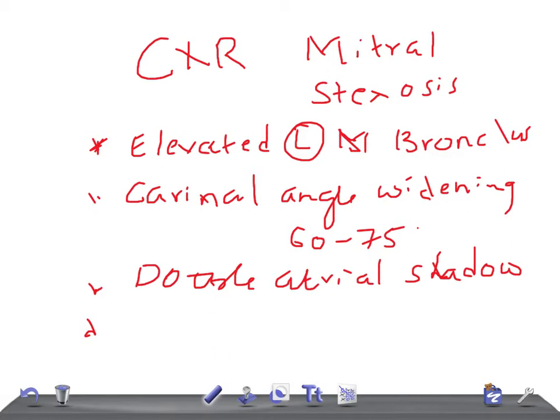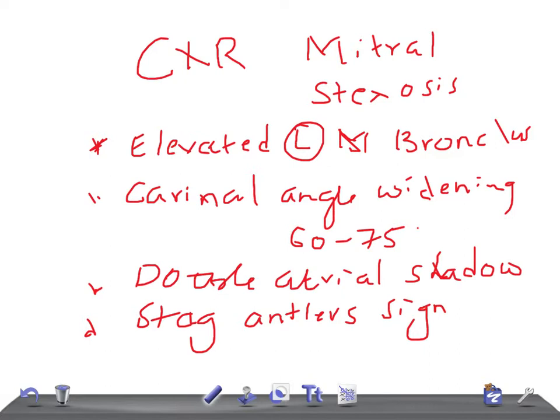Upper lobe venous diversion with prominent upper lobe veins — this is known as the stag antlers sign. The upper lobe veins will be very prominent in mitral stenosis.